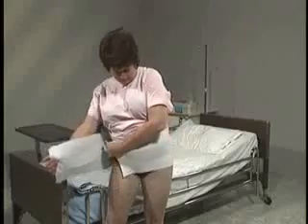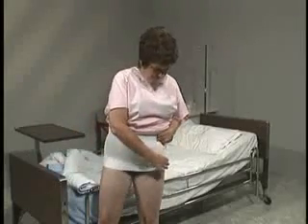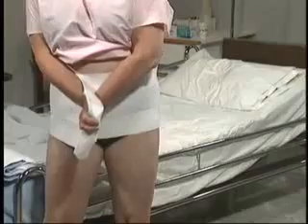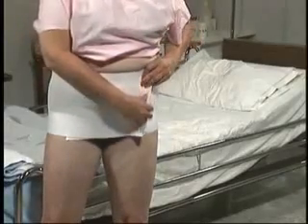Once the patient becomes ambulatory, the binder may be applied while he or she is standing. To do this, the patient or the nurse should position the top edge of the binder just below the navel, with a soft lining against the skin. Then stretch both ends out sideways. Wrap one end around, and then the other. Finally, press fasten the continuous Velcro closure and position the binder for an ideal fit.